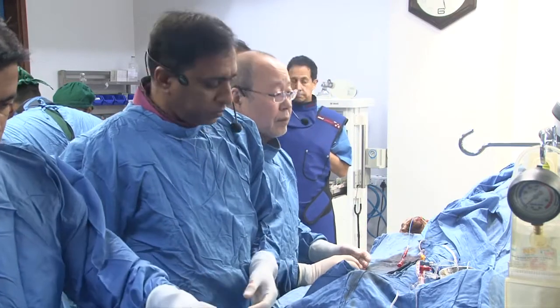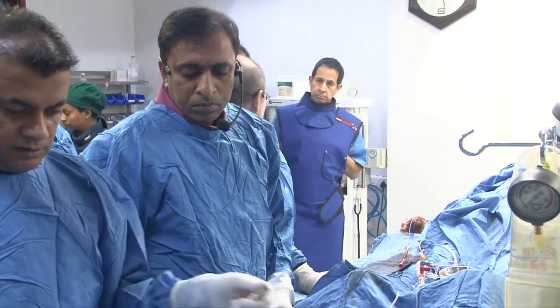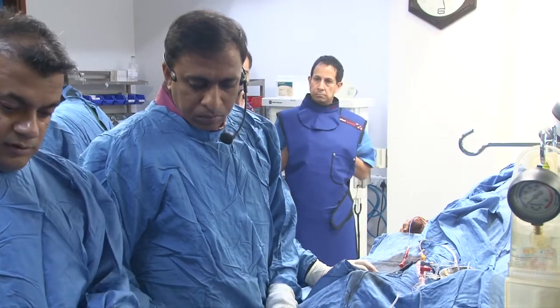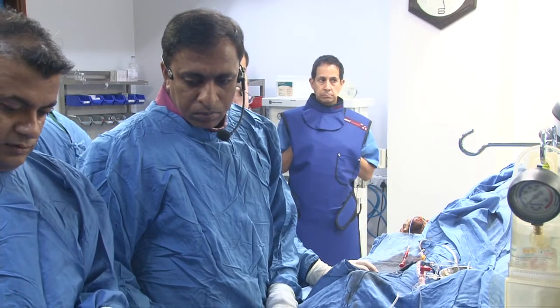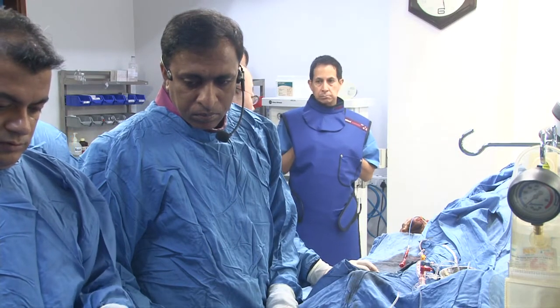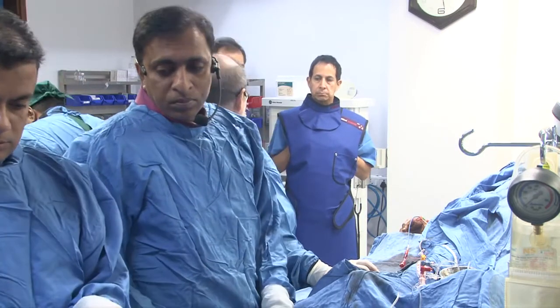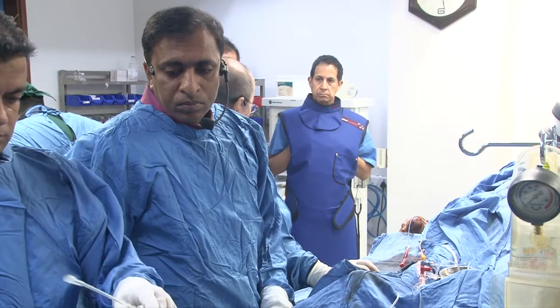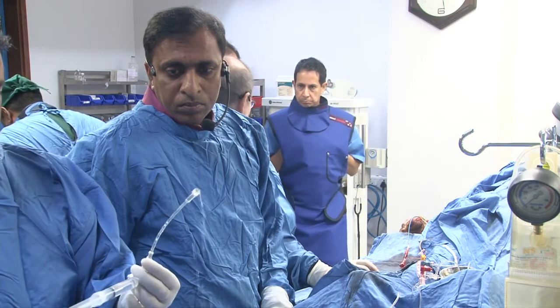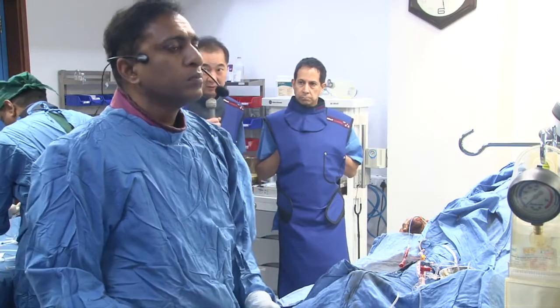If you see a lot of calcium, would you do atherectomy? Yes, even though maybe your wire is subintimal, in this case I will take a Rotablator. Even though your wire goes into the subintimal space, you think it's okay, right? Yes, no problem. 1.25 or 1.5? No, at least 1.75. Start with 1.75. No problem for subintimal. Maybe only 1.75 I take, and then after that I will place a stent. Otherwise, we cannot achieve enough expansion of the stent.